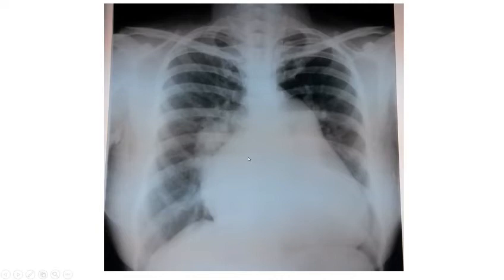No, that you can be certain, but of course, the RA enlargement in a patient with a shunt lesion goes more in favor of atrial septal defect. This RA is significantly enlarged. You can see end-on vessels, plenty of them. The pulmonary artery segment is large. All put together, it is suggestive of a shunt lesion, and cardiac enlargement and right atrial enlargement all go in favor of the lesion being atrial septal defect. I think very good. Yes.